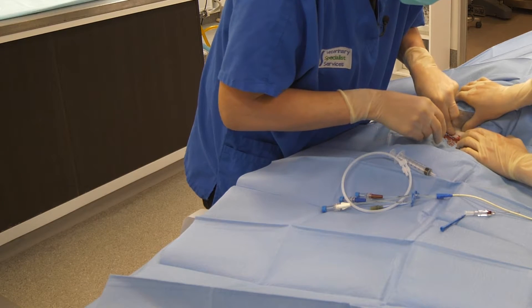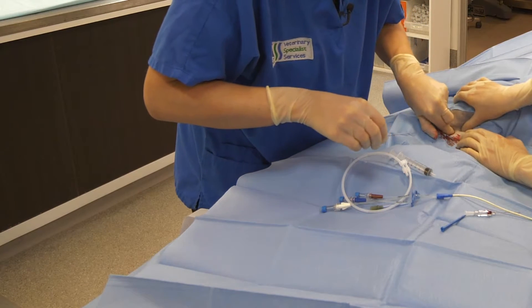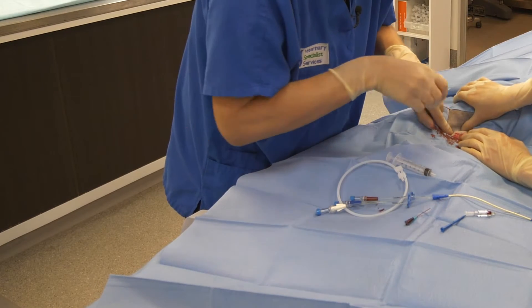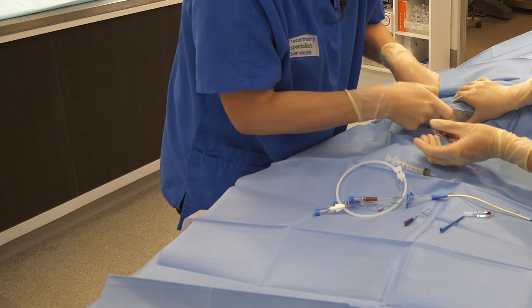We're going to put a little bit of pressure, and then we insert the dilator. Just press a little bit of pressure there, Biffy.